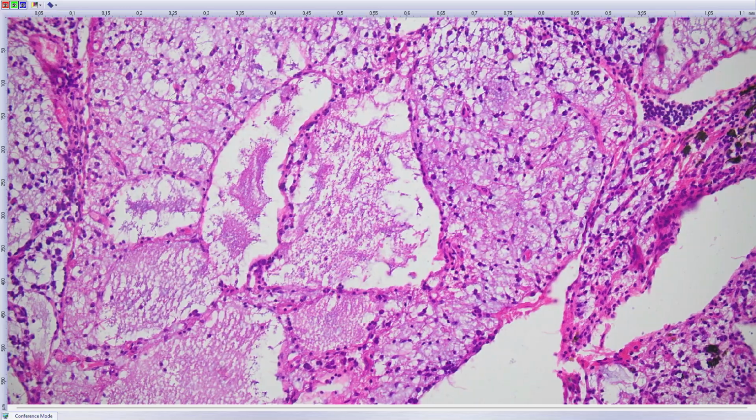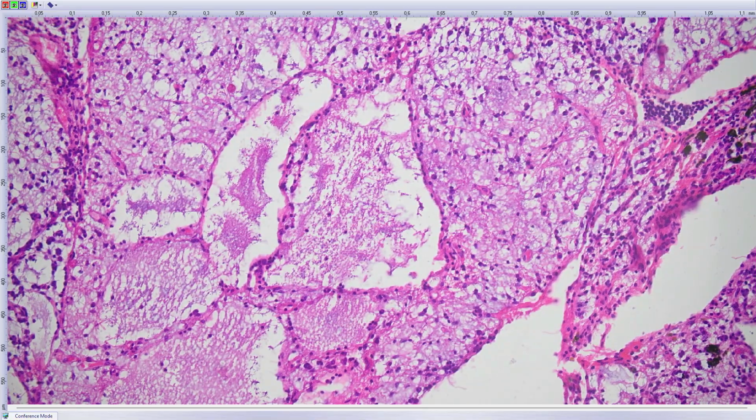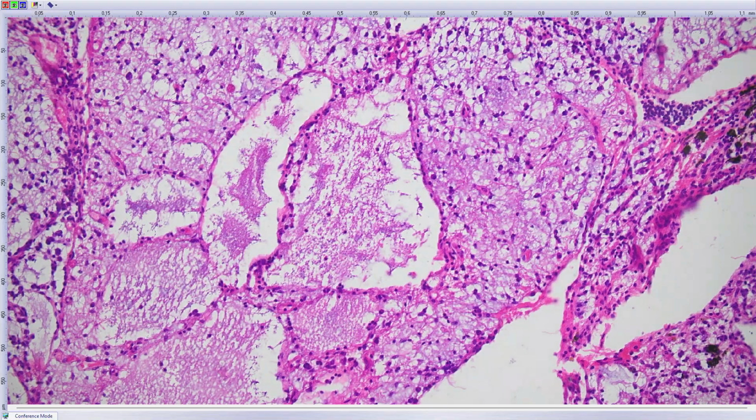We had this case for many years, for 8 years, and 8 years ago, the late Andra Hess described this lesion as probably myxoid liposarcoma, which at his time was the best diagnosis, I guess. But this tumor now was described as a tumor having recurrent mutation PDGFB, which is a mutation that could allow patients to be treated by imatinib if the tumor would be too large or too recurring. But the 6 cases they published about this tumor behaved in a benign way. They call the tumor microcystic fibromyxoma of the lungs.